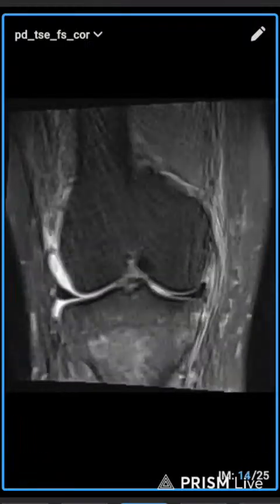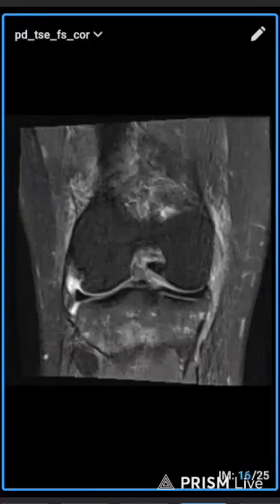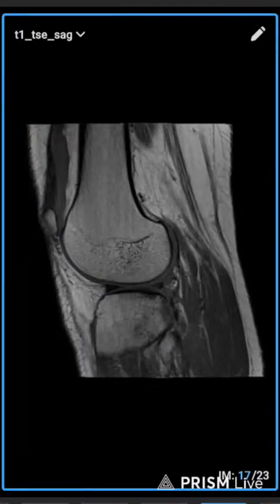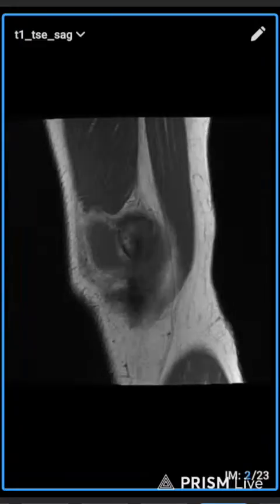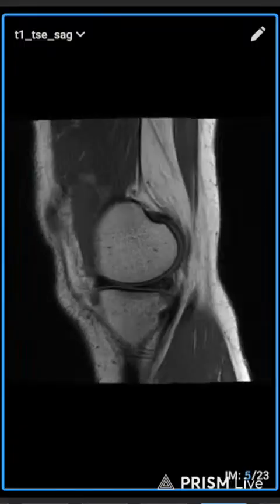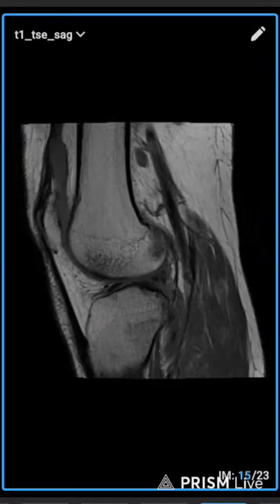It does not appear in MRI. The patient had some movement in this slice, so it's blurry. In bone, T1 is hypo, which means there was some type of infection or lesion in the bone, so the bone is not healthy. It means there was an infection.